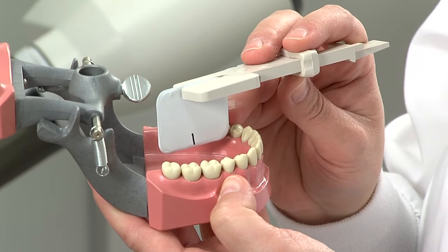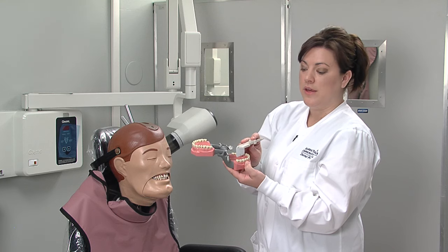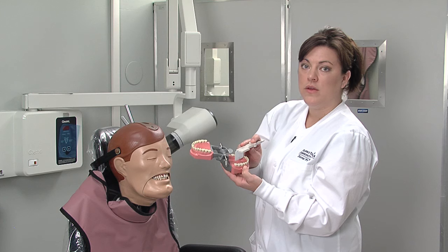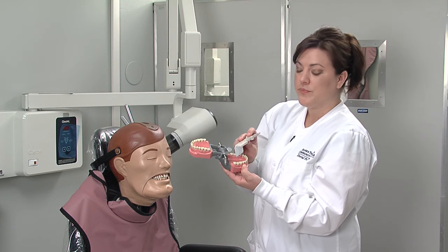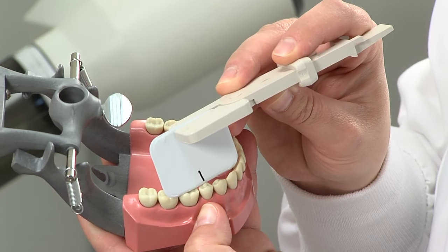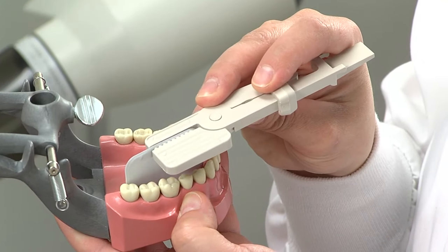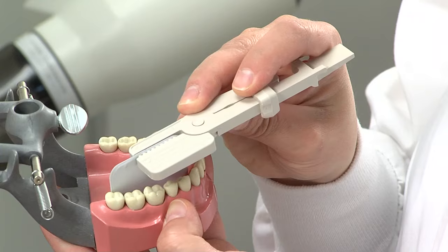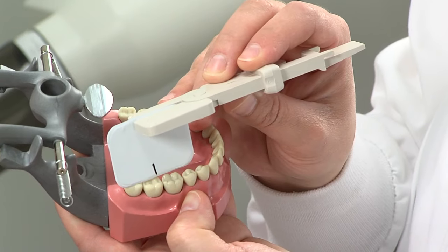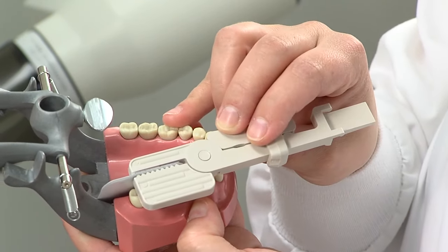Moving down to the mandibular arch, the landmarks we're looking for are the same as the maxillary posterior — we're looking for the second premolar and the second molar to line up the center of the film. When positioning the mandibular premolar periapical, we're going to line up the center of the film with the second premolar, place it, and have the patient bite down. For the molar shot, we're going to line up the center of the film with approximately the second molar, then place the film and have the patient bite down.